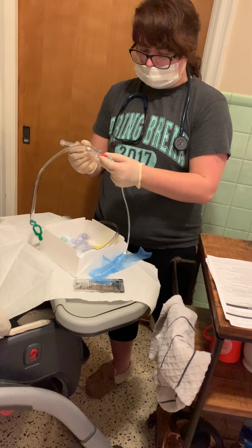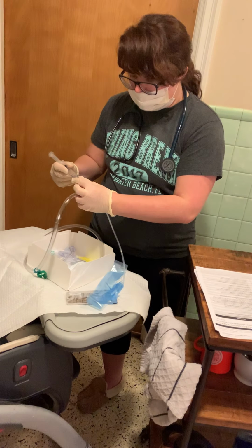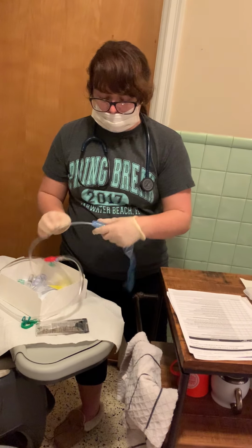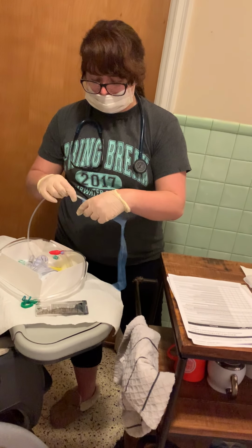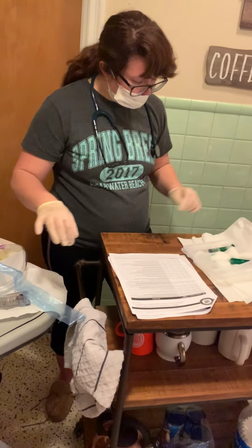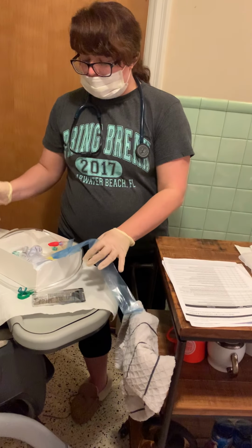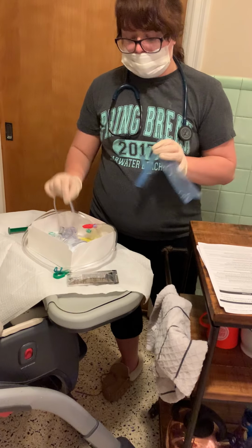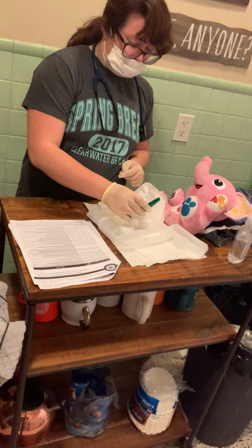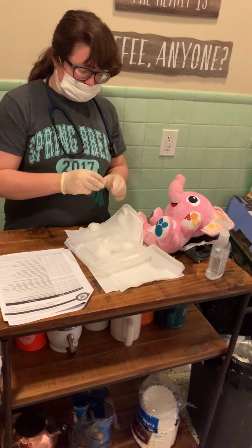I would then attach it there. I'm not actually going to do that because I don't want to use this yet. So that would be attached, and I would remove the plastic piece to my catheter. The sterile lubricant would be placed in the corner of the box, and I would be soaking the tip of my catheter in that. Alright, so this is moved down between my patient's legs.